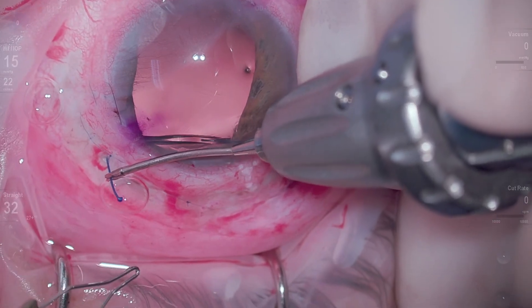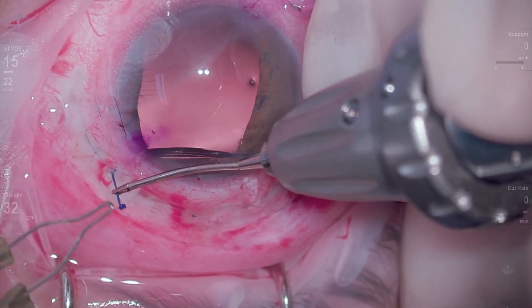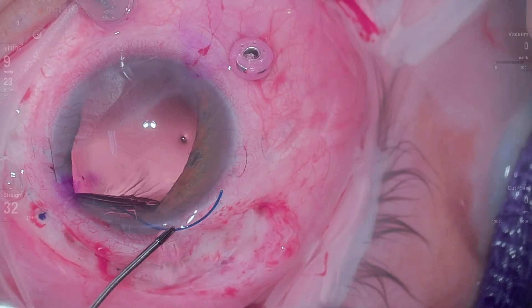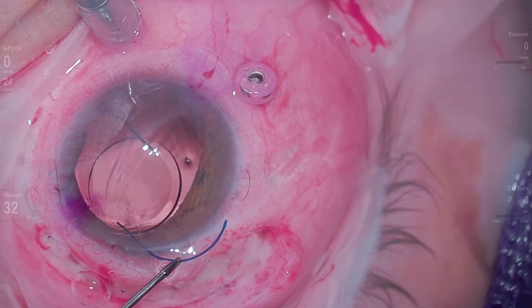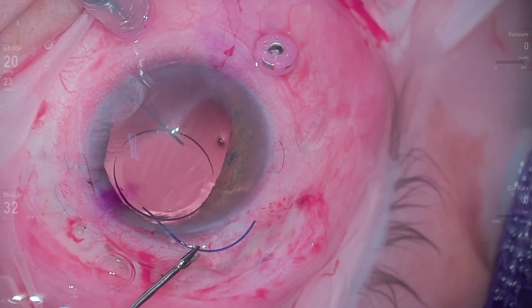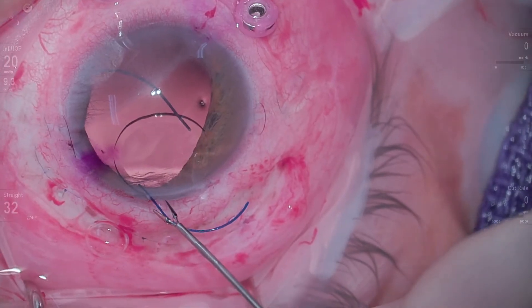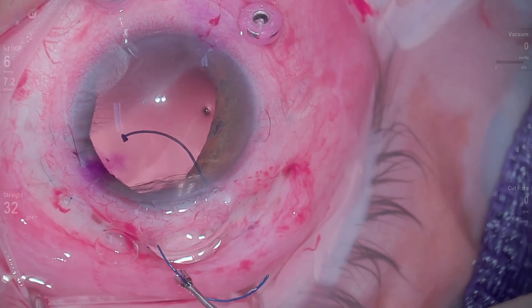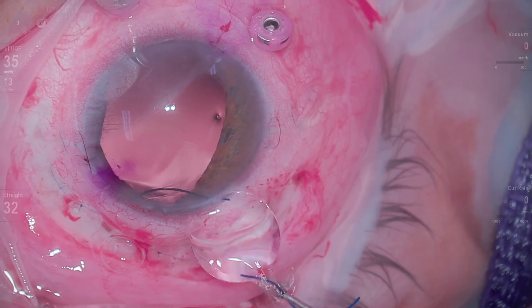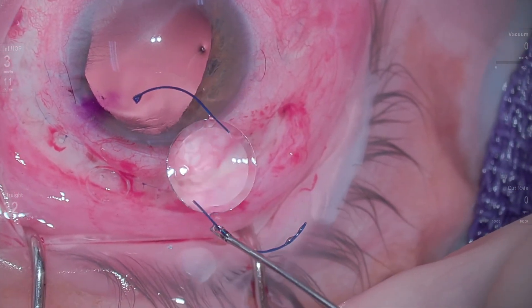We get the first haptic out really nicely. At this point they're saying you've got about five minutes. We use the cautery to barb the end of that haptic and push that end in. Anesthesia is saying how much time do you need. We decided: let's live to fight another day. So we externalize this lens and leave the patient aphakic. He can come back and have a lens placed secondarily, probably in a similar approach. A little disappointing, very humbling — that's happened to me before, but never in a situation where we couldn't at least try to go back and have another shot at it.